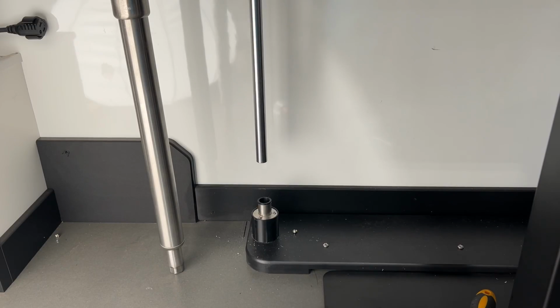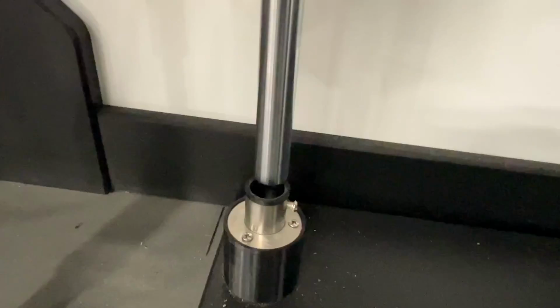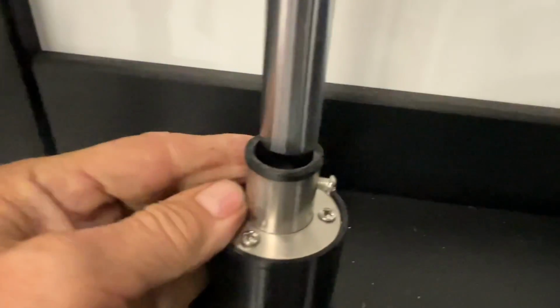Now we're going to go under the table and you'll see there's a little bit of a gap. We're going to grab the rail and work it down till we get to the flange like this. Leave it sitting on top of the flange. Do not put it down in the flange yet.